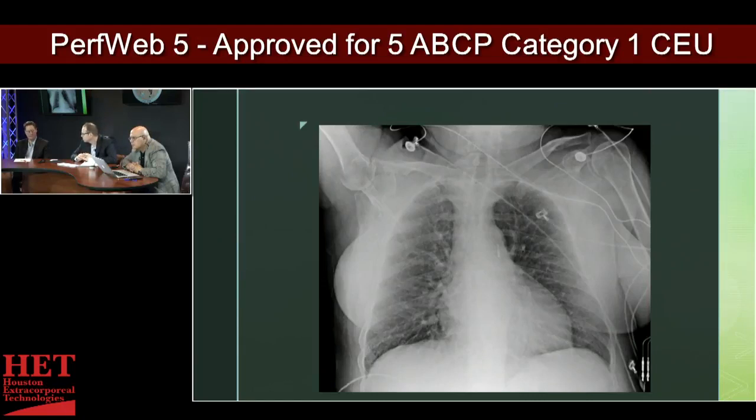If you notice, some surgeons, before they put the balloon pump in, will take it out and hold it up on top of the body to get an idea where the knob of the aorta is and where the balloon tip should be. And they take it along the patient and look at where the area on the catheter is at the end of the sheath. And so you have a rough idea where you need to start. So you can send the balloon pump up the artery until it's at about that position, and then you start looking for it on the echo, et cetera.